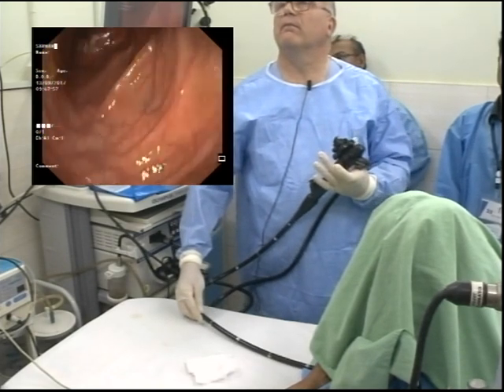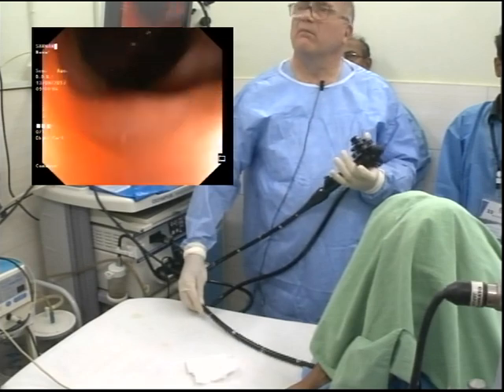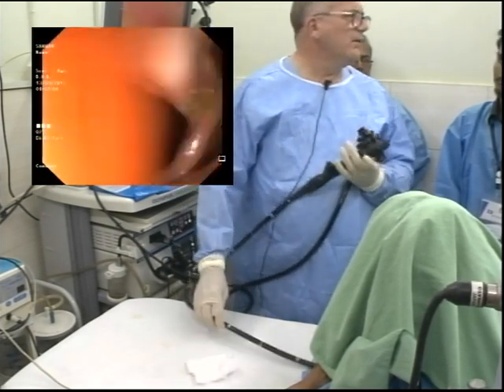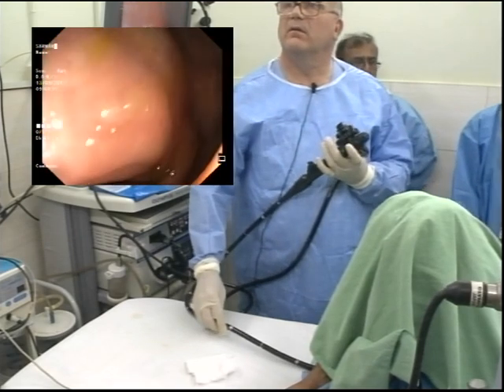How do you give pain to the patient? What causes pain in colonoscopy? Stretching. How do you stretch? By air and by scope. How's he doing? Yes, Paul. Okay. Push there.